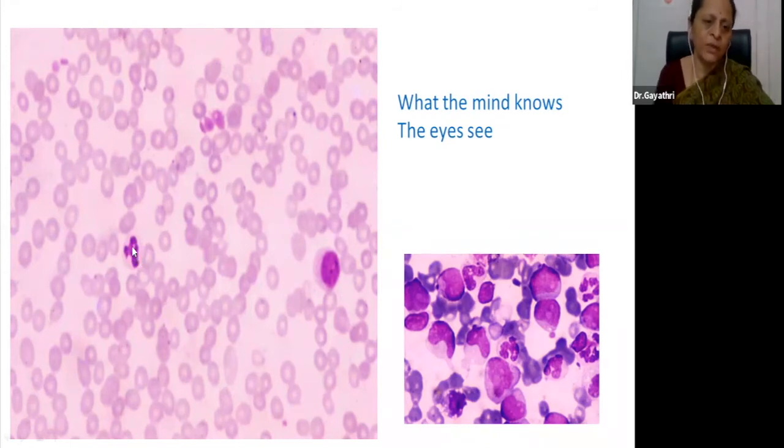Definitely not a normal nucleus in a mature neutrophil. But accompanying these, there are some telltale signs. Don't miss them. Look at these cells here. Amidst RBCs, these two are platelets. These have the same staining property. They are almost the size of the red cells, and one of them has spikes, but the other has smooth contours. These are giant platelets.